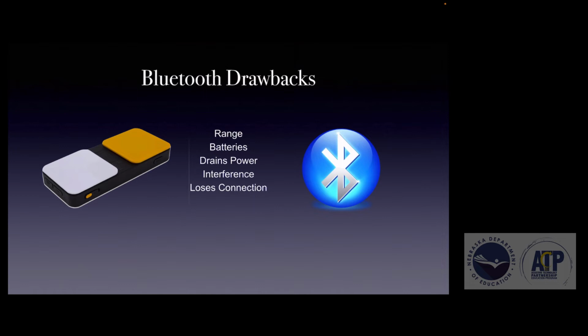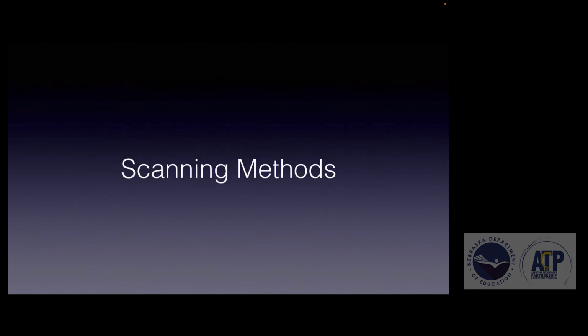They do drain power because you're using wireless, and it's always trying to look for those signals. You can get interference from other Bluetooth devices, so latency could be a problem. You hit the switch, and there might be a slight delay. This has gotten better over the years, but there's also a tendency to lose the Bluetooth connection, and you need to reconnect that device.